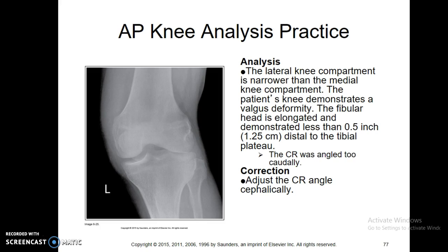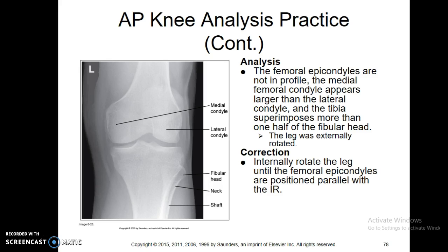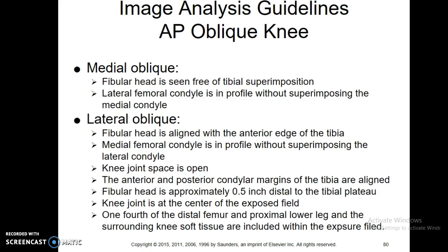Knee, just watch the bend in the knee. Make sure it's not rotated at all. The patella should be right in the middle of your image. The intercondylar eminence shouldn't be shifted off to one side. You can see the intercondylar fossa also coming in at a little bit of an angle. So make sure it is straight up and down.